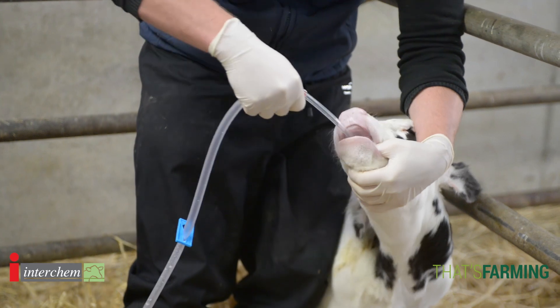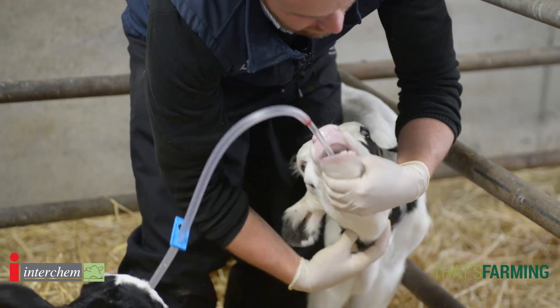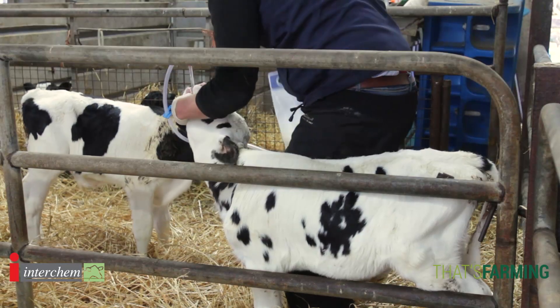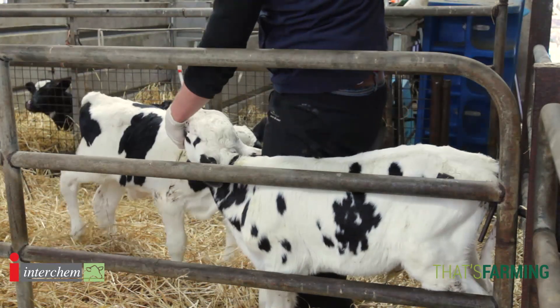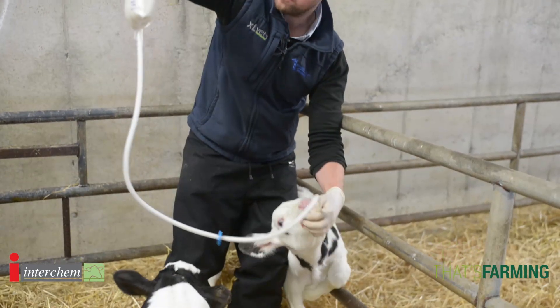We gently insert it to a point just about here, and I will feel the neck — again I can feel the windpipe and I can feel the stomach tube. I'll bring up my bag and begin the process, holding the calf and the stomach tube.